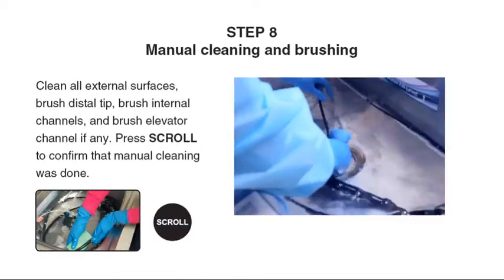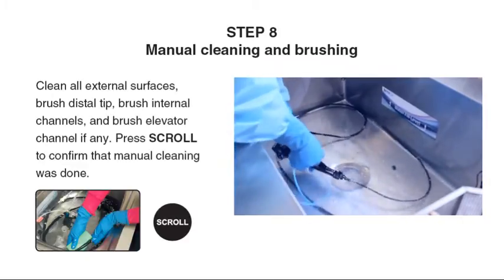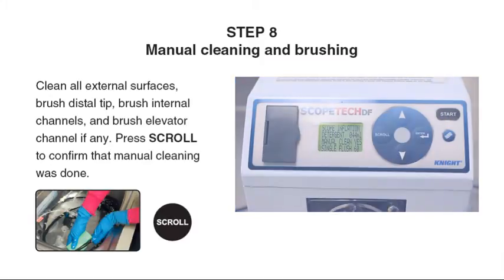Step 8: Clean all external surfaces. Brush the distal tip, brush internal channels, and brush the elevator channel if applicable. Then press scroll to confirm that manual cleaning was done.